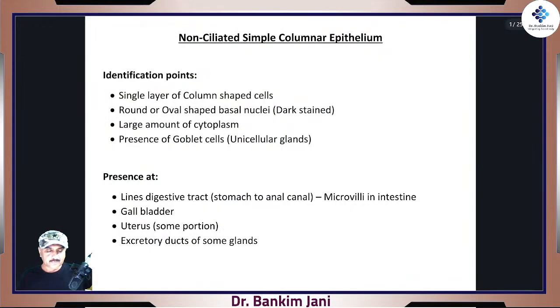This time we are watching, you remember cilia? Cilia, right? What was the name of that protein? It can be in the cilia too. Well, now you will see. Cilia had that protein dynein, which was our molecular motor, correct? It was our molecular motor.